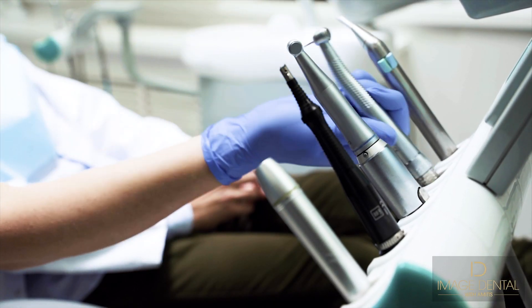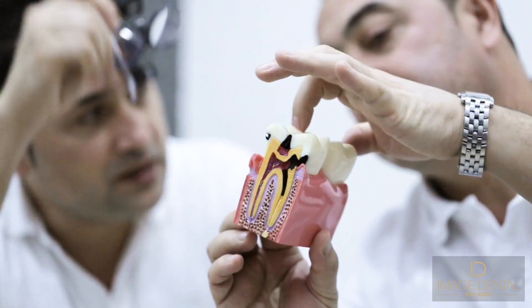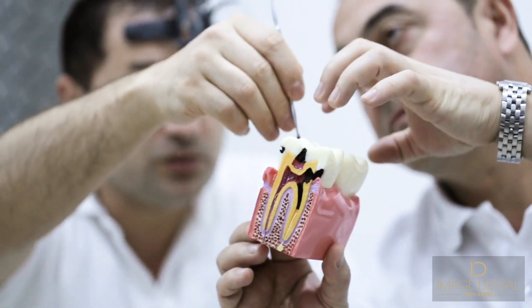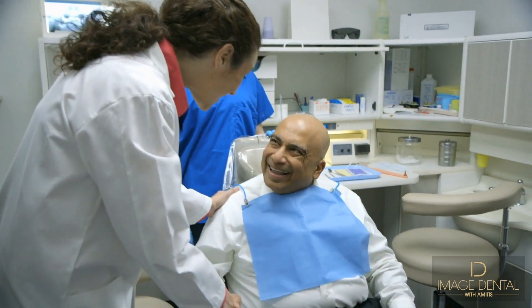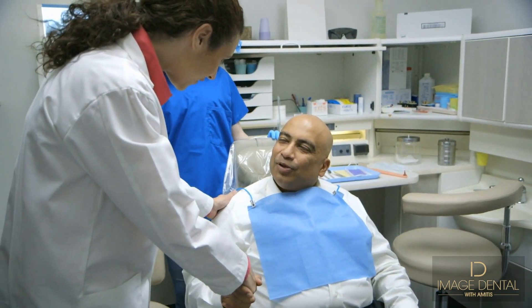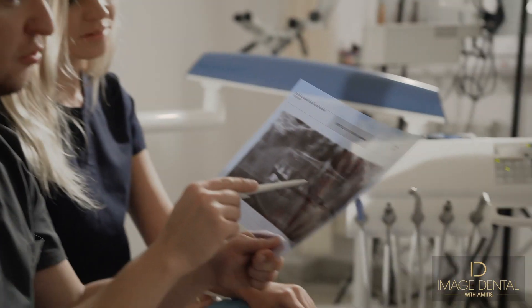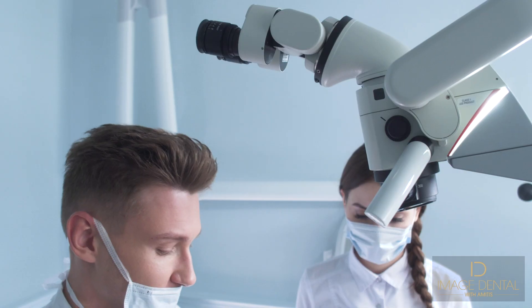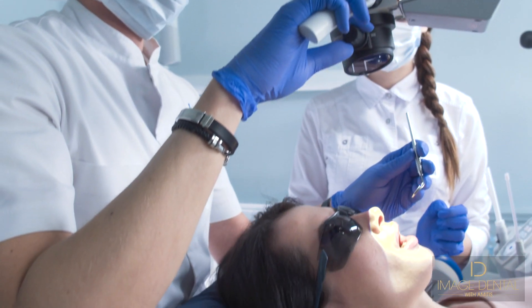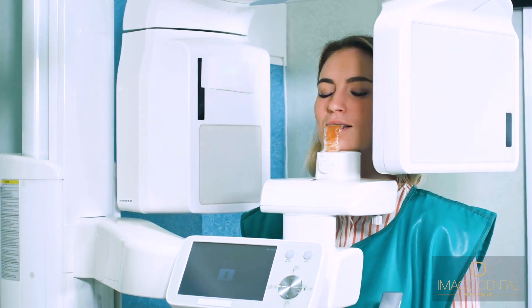All dentists are trained to perform this treatment and your dentist will be able to do it. However, some treatments can be complicated and require referral to an endodontist, or a dentist with special interest in root canal treatment. These dentists and specialists have advanced training in root canal treatment. They are experts in saving your natural teeth using advanced tools such as microscopes and digital imaging to treat you easily and safely.